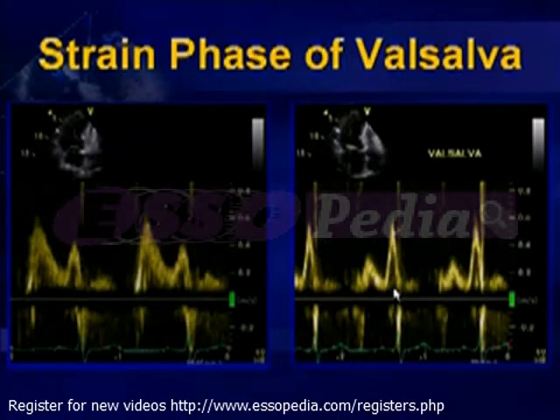Recognize, however, that smaller values do not always indicate normal LV filling pressure. And in our lab, we do not routinely use this Valsalva maneuver, but for patients in whom the question still remains about LV filling pressure after looking at mitral inflow velocities and annular velocities.